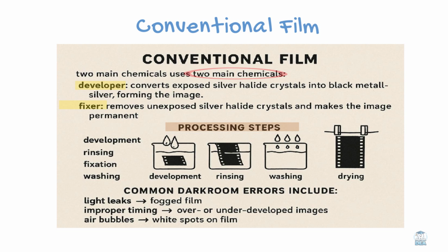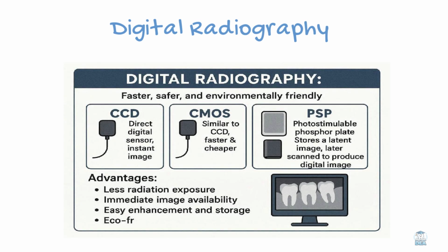Common darkroom errors include light leaks causing fogged film, improper timing leading to over or underdeveloped images, air bubbles leaving white spots on the film. Next, we move to digital radiography, faster, safer, and environmentally friendly.